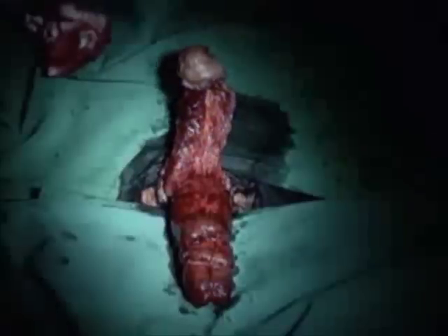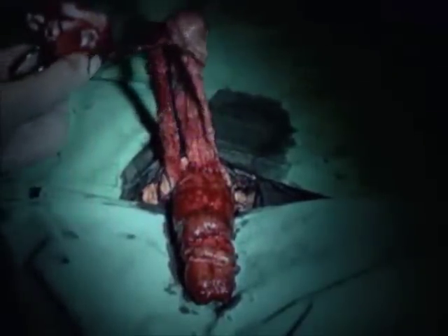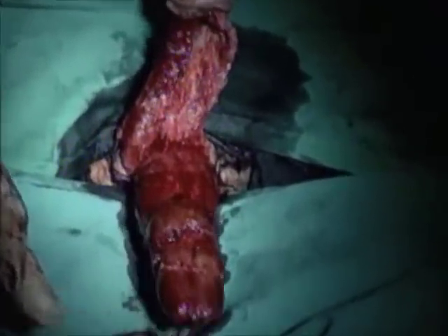The clamp is removed. An erection is re-established to verify excellent correction of deformities. Graft bulging is visible.